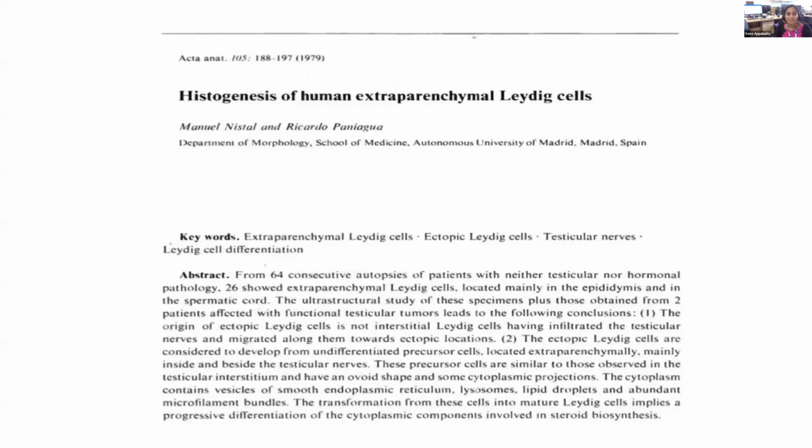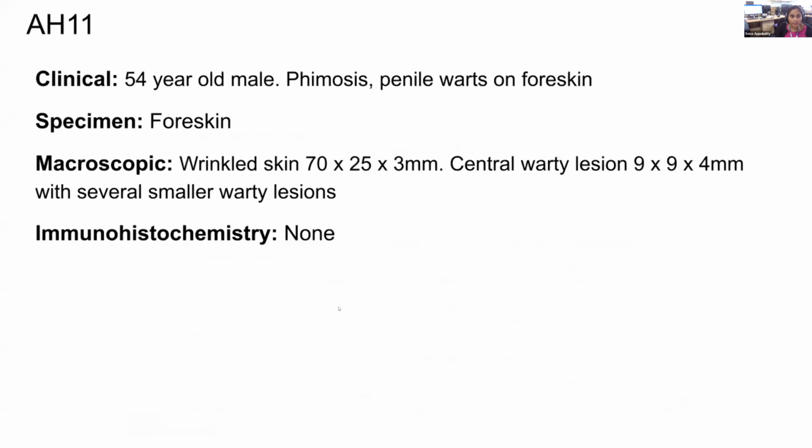A beautiful article, if people want to go over it, especially because when you have a testicular tumor and you notice this, and if you have not noticed this before, people might panic and think there's a spread outside. So it's a good one, if anyone wants to read.